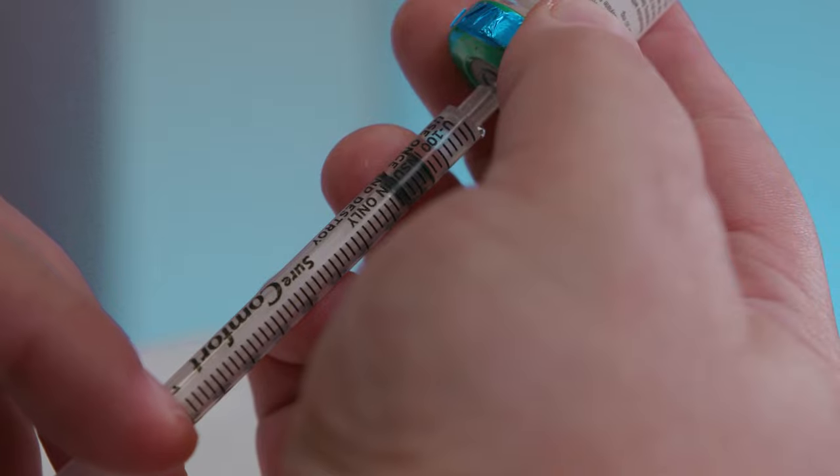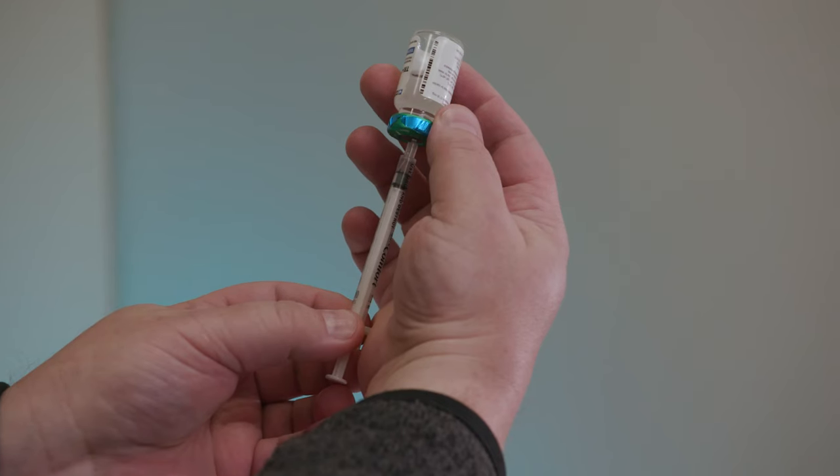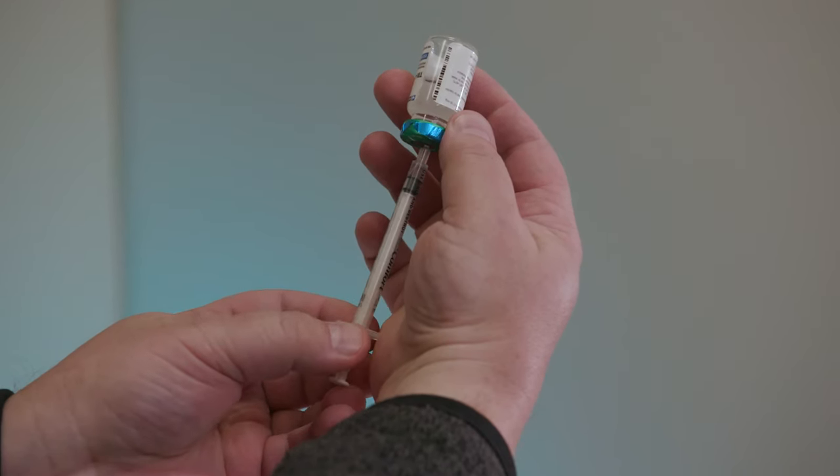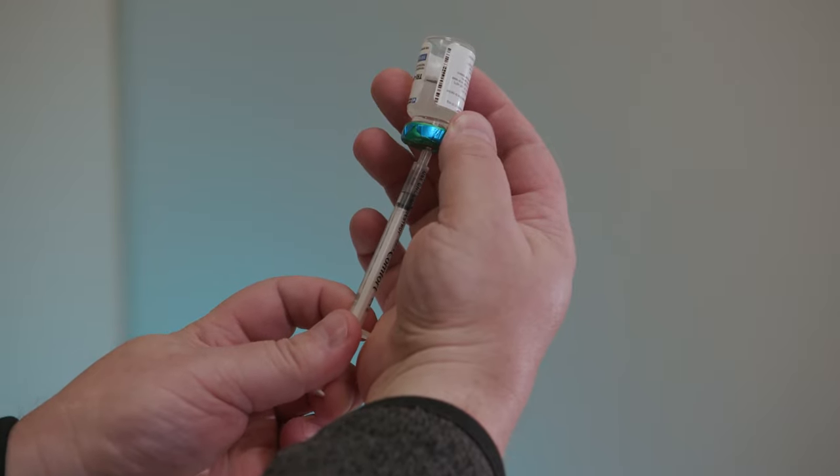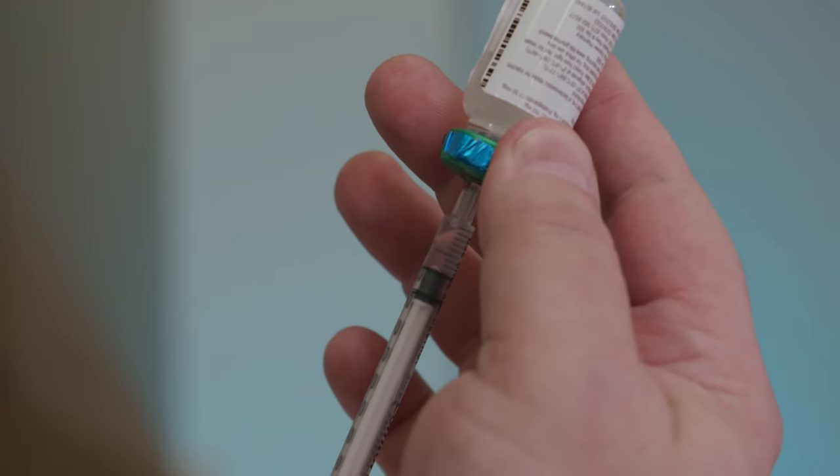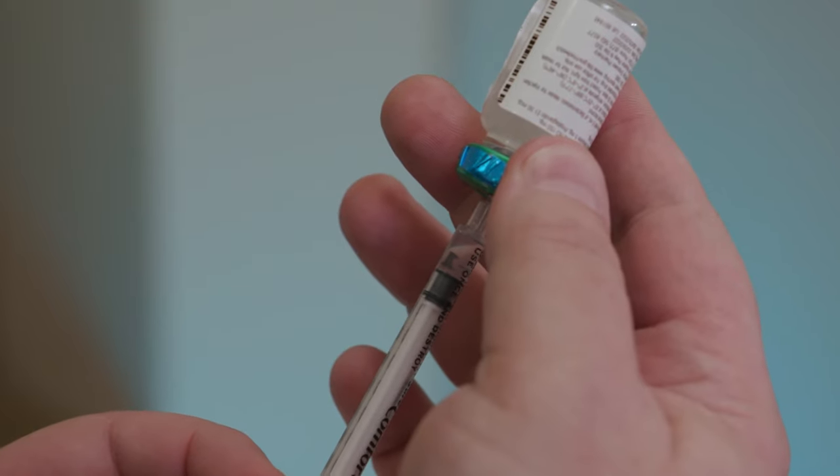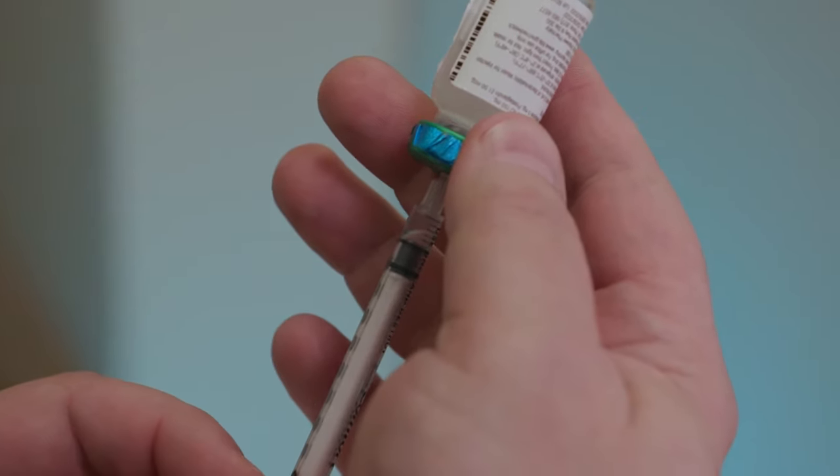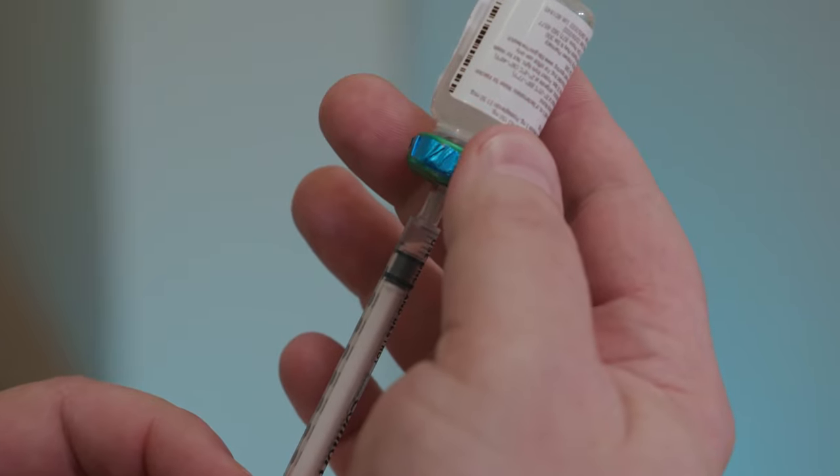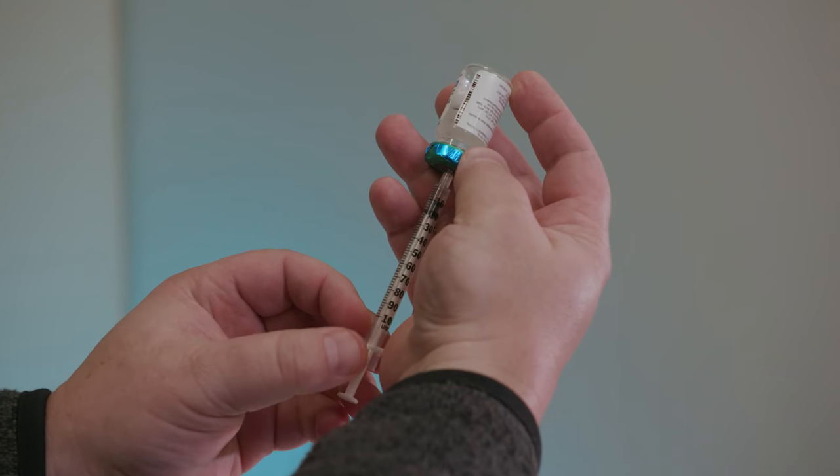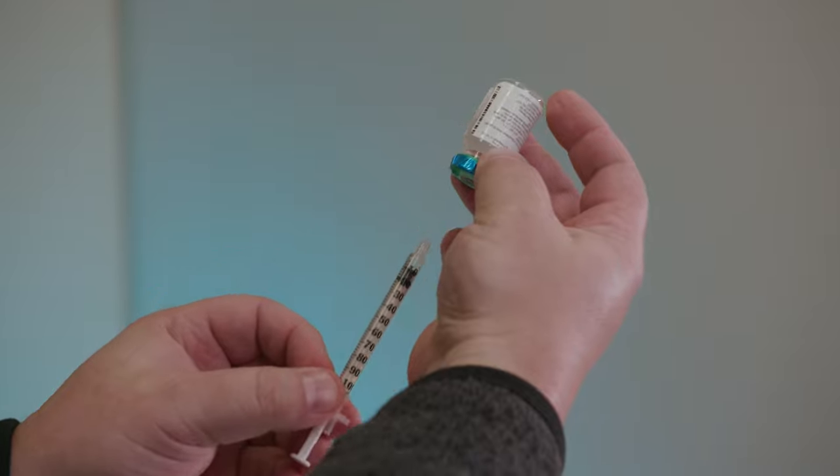Without taking the needle out of the vial, look for air bubbles in the syringe. If you see any, pull more medication into the syringe. Then, slowly push the air bubbles and extra medication back into the vial. Check the amount of medication in the syringe to make sure it's the right dose. When you have the right dose, pull the needle out of the vial.